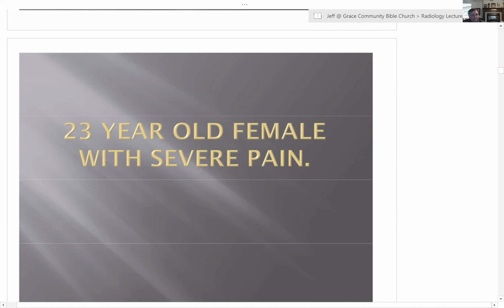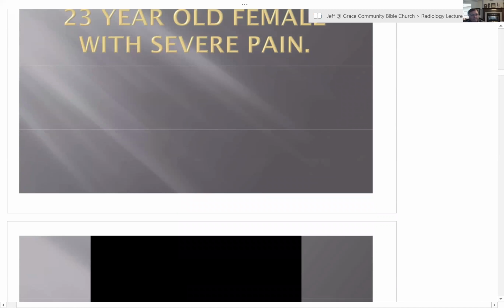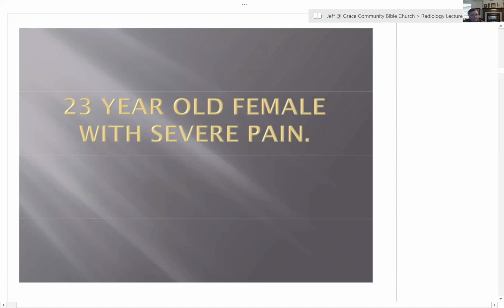23-year-old female with severe pain. All right, and I will give you a little more history in a second. Hey, Jim, just as far as the history people give to you, do you want more than that? That's a great question. We have these forms that you fill out, and you guys are busy and we're busy. So what I want is just enough information that you think is pertinent to the case. So when you check a box, there's no history of trauma, that's helpful. There's no history of cancer.